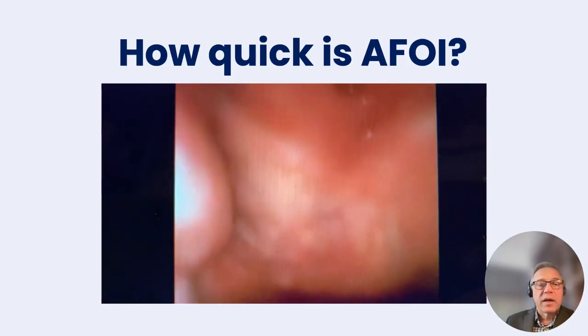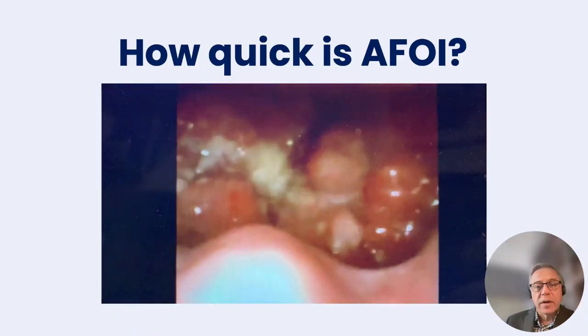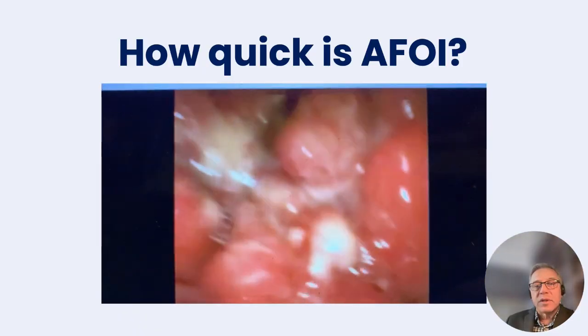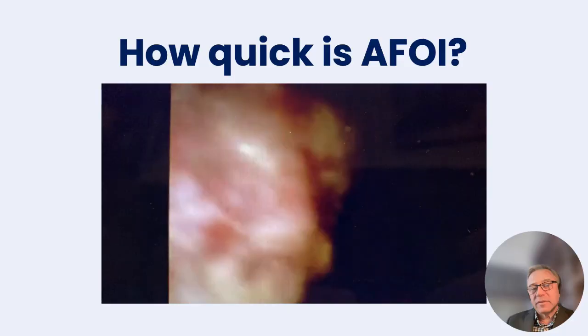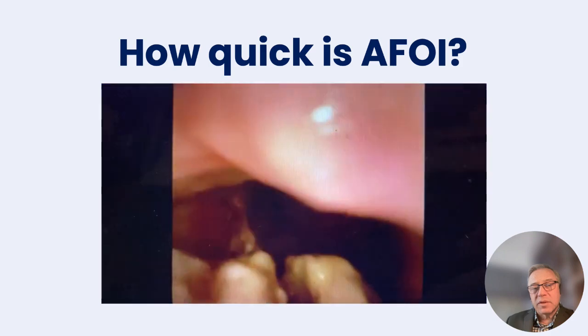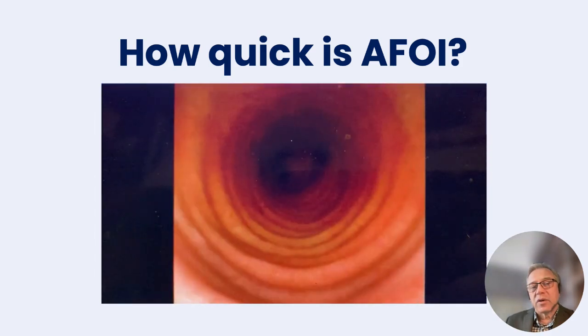How quick is awake fiber optic intubation? It's pretty quick. Have a look. This is from when it's gone through the nostril already, and this is the massive tumor of the airway. This whole procedure with the laryngeal tumor lasted 80 seconds, in experienced hands, of course. So this is pretty distorted anatomy, quite narrow, but still possible to pass the fiber optic scope. And then we are in the trachea, and then railroad the endotracheal tube. So it can be done in experienced hands pretty quickly.